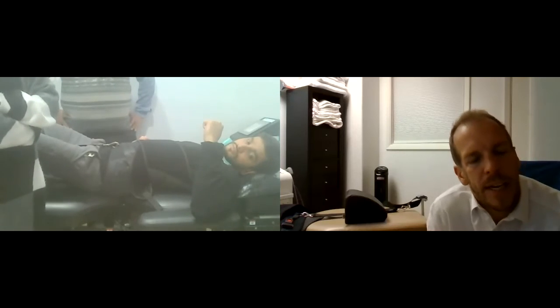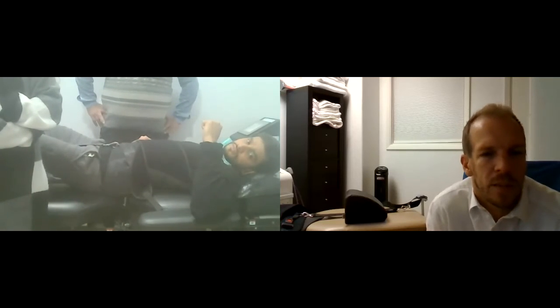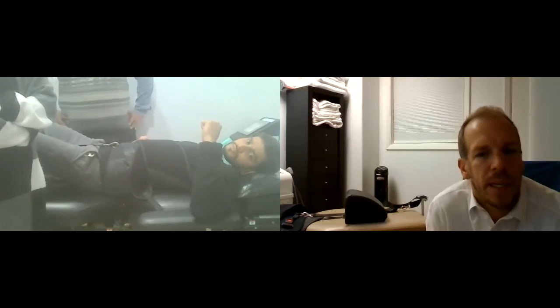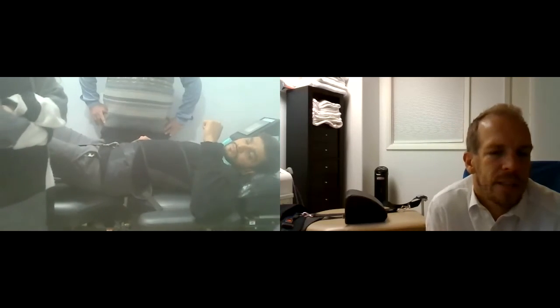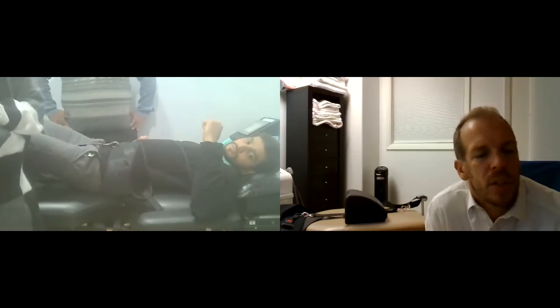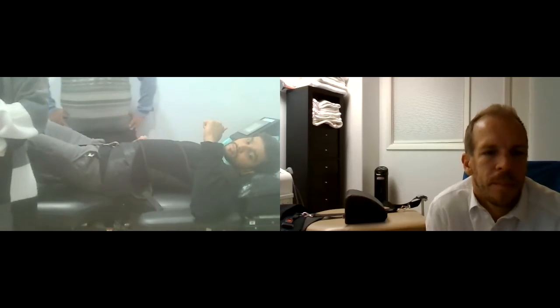If he comes back tomorrow and he was really, really sore, then you may go back to like 15 kilograms instead of the 22. So instead of 1/3, we should go to 1/4. You can do anywhere between 20% of the body weight up to 50% of the body weight as needed, for lumbar. Cervical is going to be only 10% of the body weight, but we'll do that one next time.